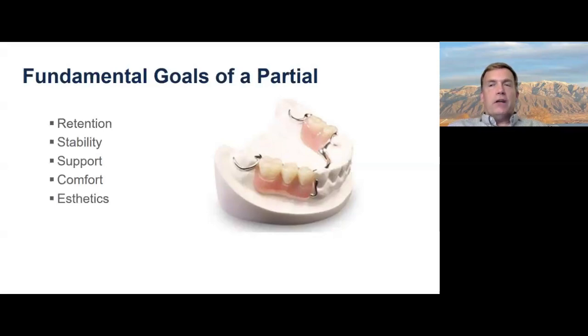So part of our conversation with the patient is, if we make an implant supported prosthesis for you, a crown and bridge case, then it isn't going to move at all. If we make a partial, it'll move a little bit. How much? Well, it'll depend on your anatomy and how you use it, but just know that it's going to move. If you've had that conversation ahead of time with the patient, good, especially if you have them sign a document that says we've had this conversation. Then if it moves, there's no frustration. When the patient says it moved, you say, yep, you're right. It moved just like we talked about.